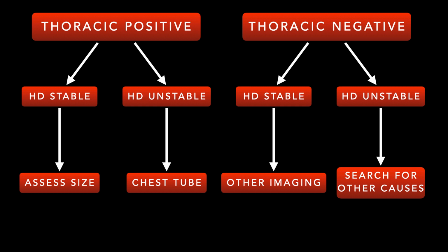Negative thoracic FAST, right? You see no fluid, you see no blood, they're hemodynamically stable. Again, we're going to send them down that route to look for other imaging, other assessments for what could be going on based on the patient's clinical presentation.